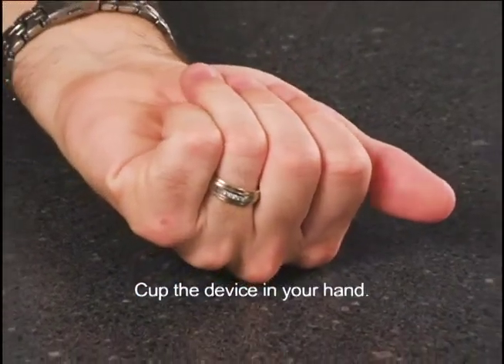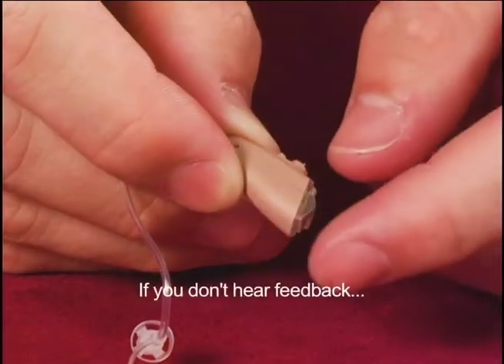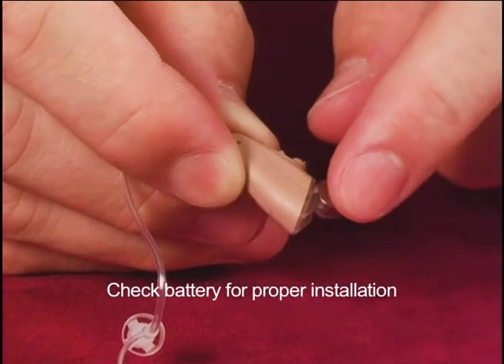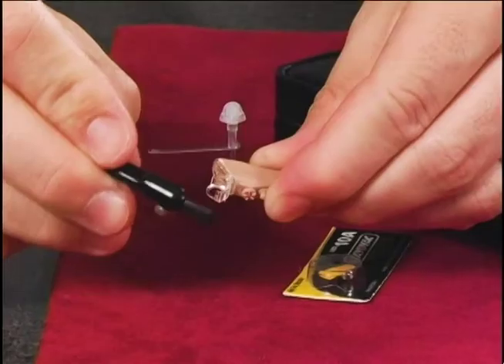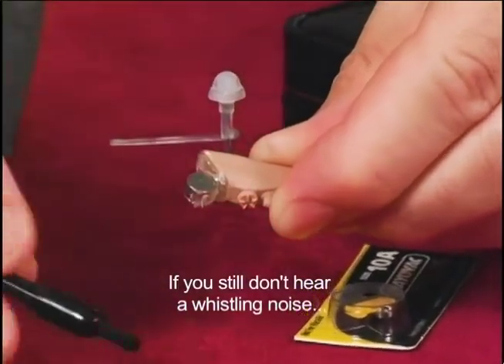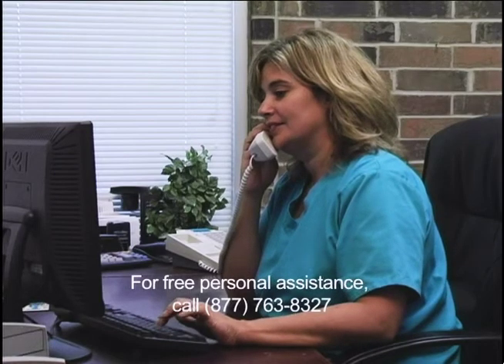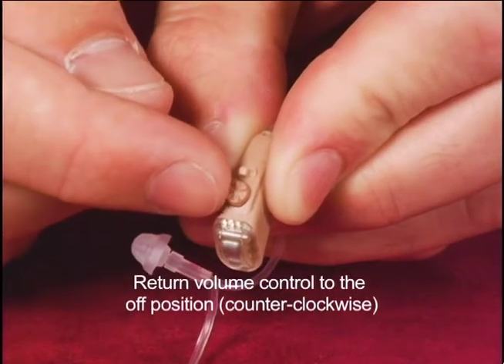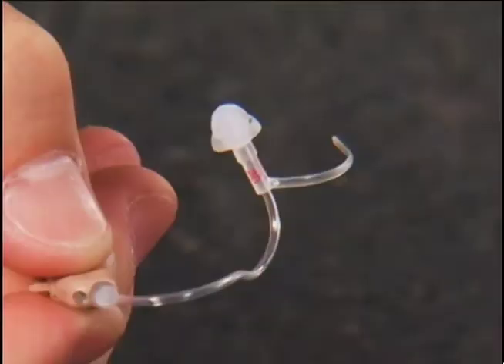Gently cup the device in your hand and hold it close to your ear. You should hear a high-pitched sound called feedback. If you don't hear anything, check to ensure that the battery is correctly installed, the door is fully closed, and the volume is on the full-on position. If you don't hear any whistling, then you may need to try a fresh battery, or call for assistance toll-free at 877-763-8327. Return the device to the off position by rotating the volume control in a counterclockwise position.